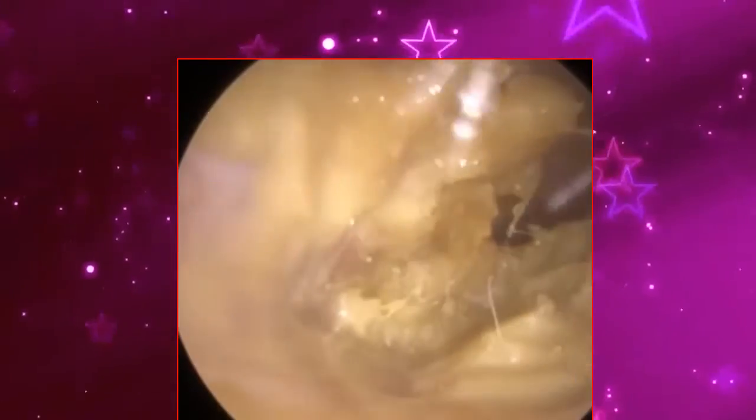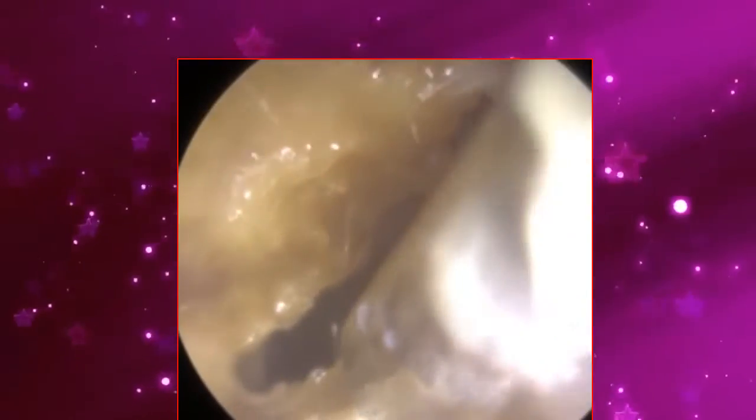You can just see at the entrance there just how dry the entrance of the ear canal is. There's loads of dry skin flakes there. With otitis externa, the ear's already sensitive, so we're going to be really, really careful. You can see throughout the video, I'm just trying to avoid contact with the canal wall, because touching that is going to be a bit uncomfortable for the patient. Whilst you're watching that, I'll go through some of the questions that appeared in my previous video.